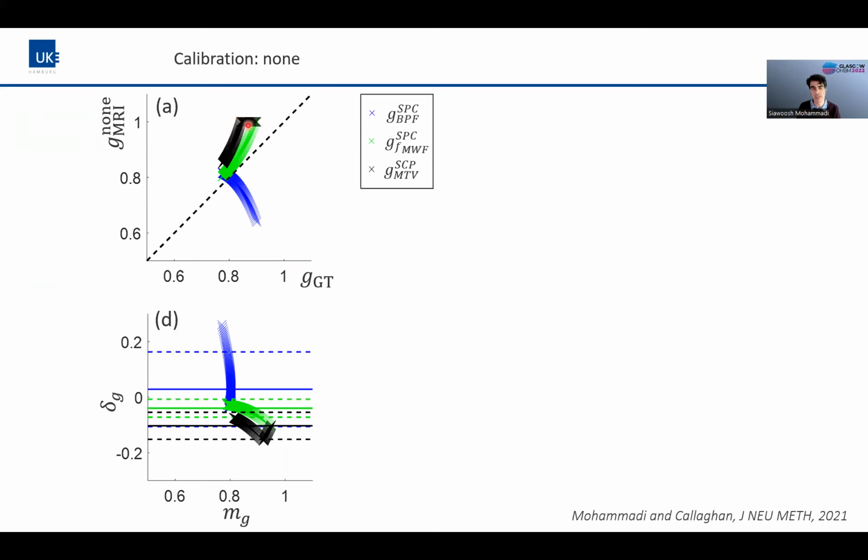And here the ceiling effect comes because the axon volume fraction can be negative, and then the expression in the square root will be negative, and that's of course not possible. So we set it to 1 when we have invalid values within the square root.